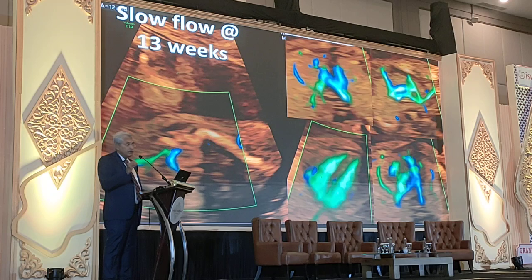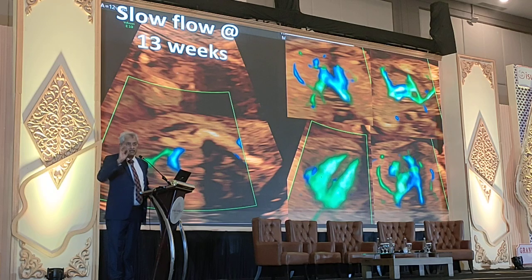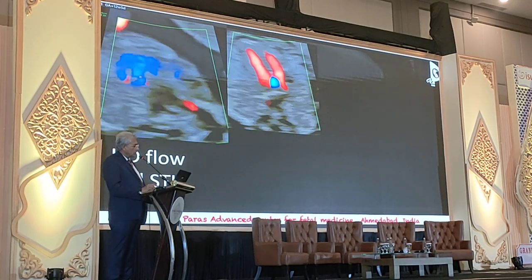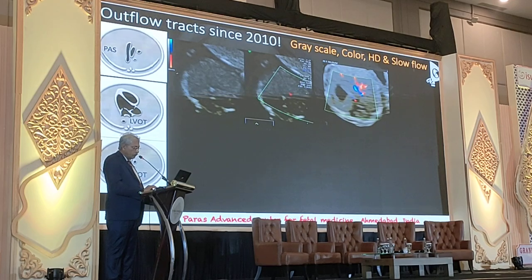To begin with, to learn first trimester fetal echocardiography, start at 16 week. Start doing echocardiography at 16 week. Gradually you reduce the gestational age, 16 to 14, and then to 12 and 13. That's how you will reach your destination, and that's what you should be aiming for, and thinking of doing in fetal echocardiography nowadays.